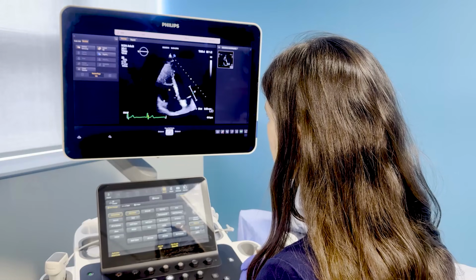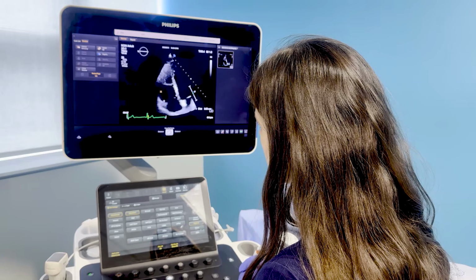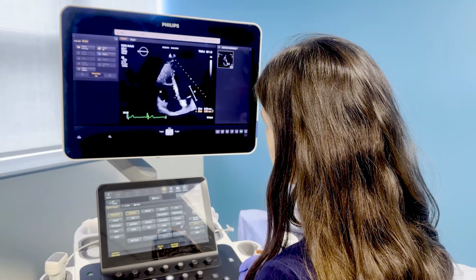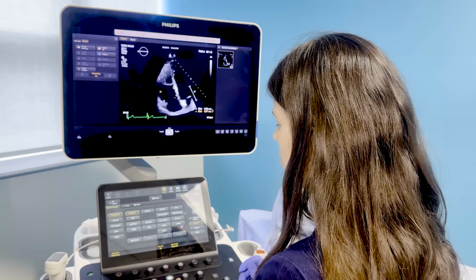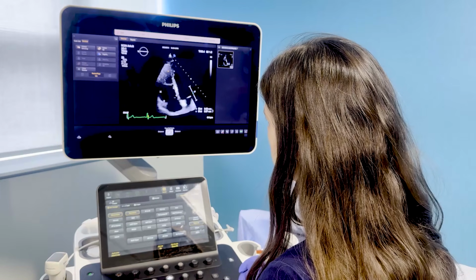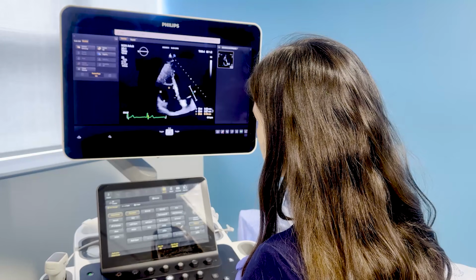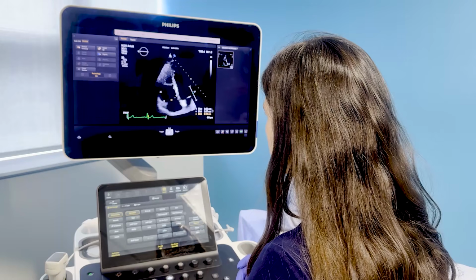Great. And now the mid-ventricular diameter. So for the mid, I'm just going to come again against the RV free wall, following the exact same angle. Kind of midway between the annulus and the apex. Okay. And then the longitudinal diameter. So for the longitudinal diameter, you want the apex. It's not the most clear, but I think it's right in around here. And then you want to go just kind of midway to the annulus of the tricuspid valve.